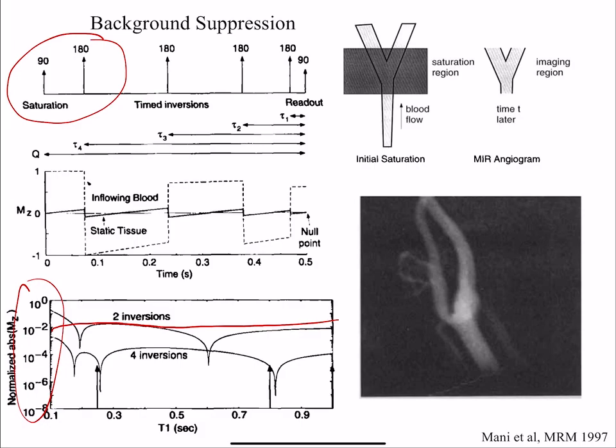Question? Does that happen because it's the physical matter of the body that gets affected by magnetization? So when you have blood flow where the spins haven't been affected by the RF pulse, then you can see that blood because it hasn't been, sorry.